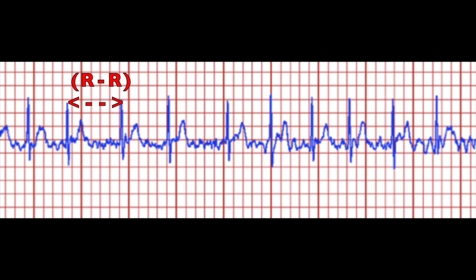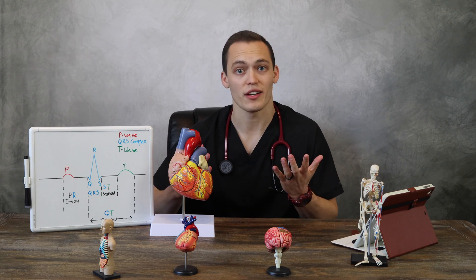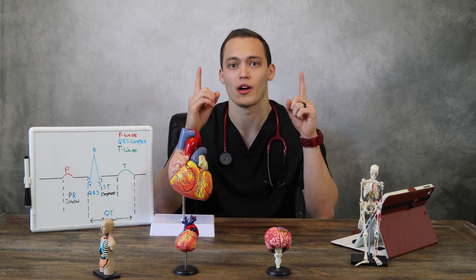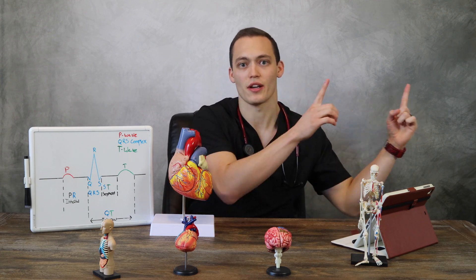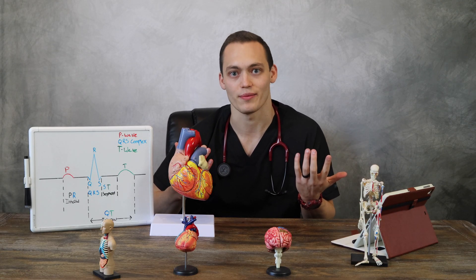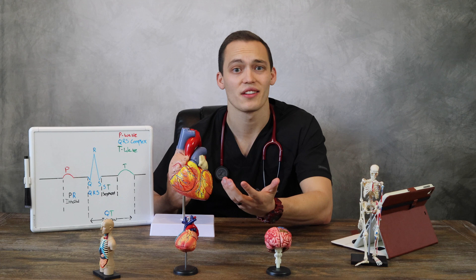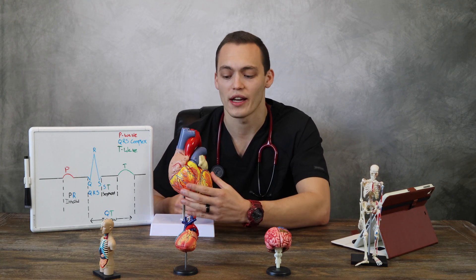I'm going to put up a strip of atrial fibrillation so you can see. Another way to look at this on an ECG strip is the R-to-R interval — if AFib is present, the R-to-R interval will not be equidistant. The ventricular rhythm will be variable and not regular. Regular means the R-to-R interval is equidistant throughout the strip. Just because there's an irregular rhythm does not mean the ventricles are not functioning properly — they're functioning just fine, just not at regular time intervals.